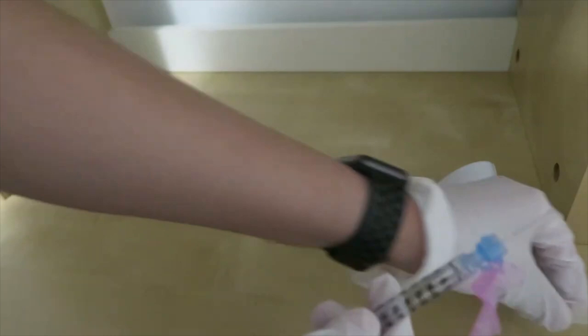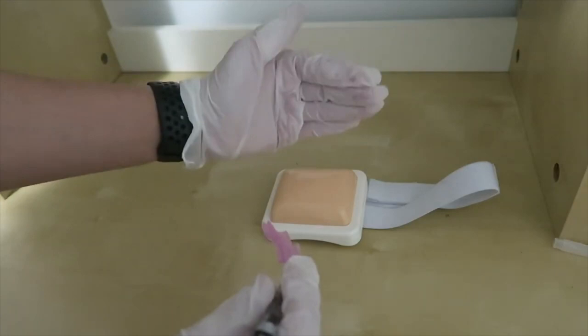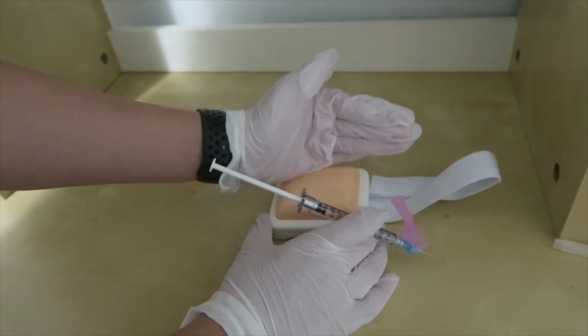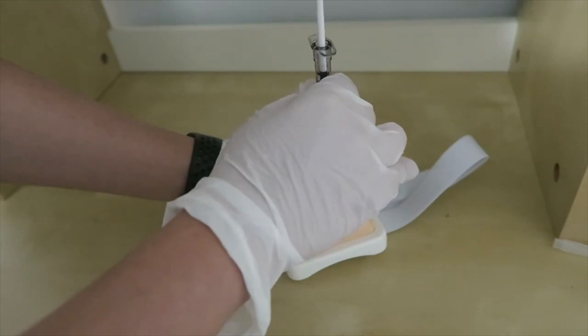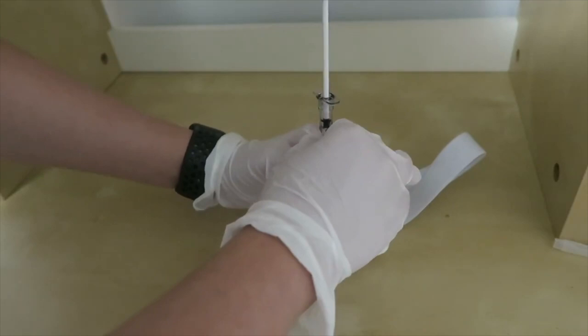So just removing the safety and uncapping the needle, I'm going to use the Z-Track method with my non-dominant hand. So just like so, sorry it's a little hard to demonstrate because this is so small, but using the Z-Track method like so, and sort of pulling the skin at a 90 degree angle, I'm going to insert this needle like so.